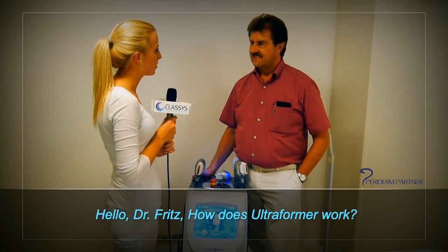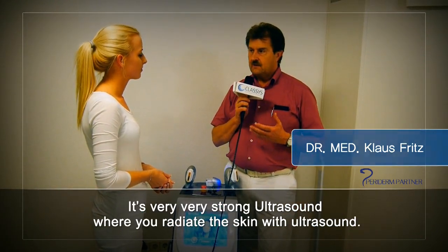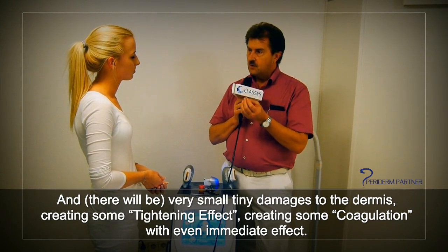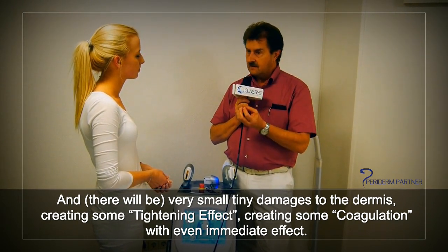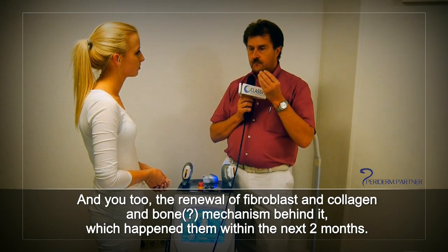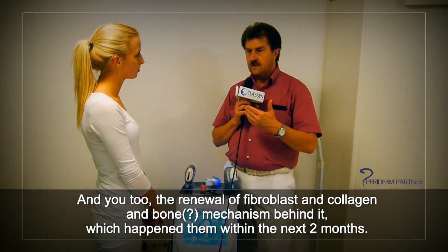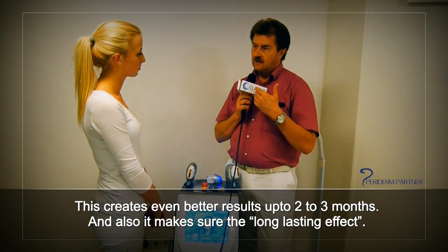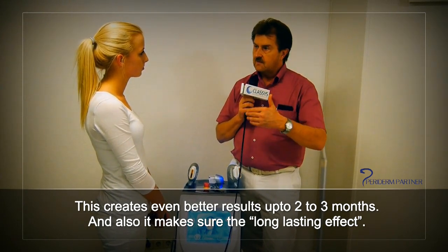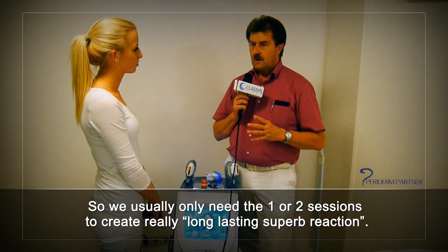Hello Dr. Fritz, how does the Ultraformer work? The Ultraformer is an ultrasound — it's HIFU. It's a very strong ultrasound where you irradiate the skin so it accumulates in the dermis, creating very small tiny damages to the dermis. This creates a tightening effect and coagulation as an immediate effect, and due to the renewal of the fibroblasts, the collagen, and the wound repair mechanism — which happens within the next two months — this creates an even better result after two to three months and a long-lasting effect. We usually only need one, maybe two sessions.